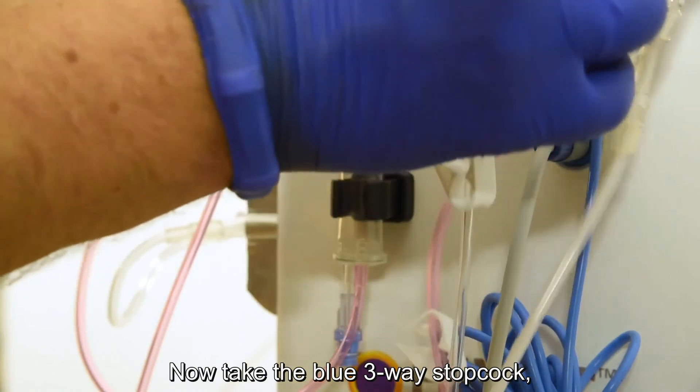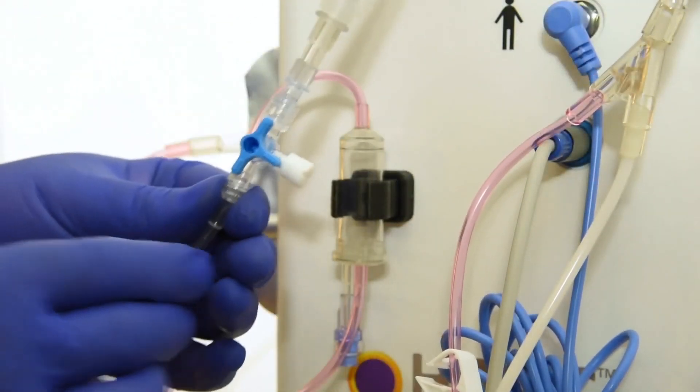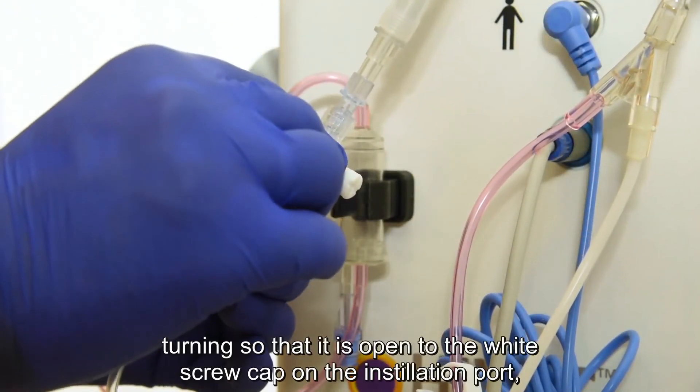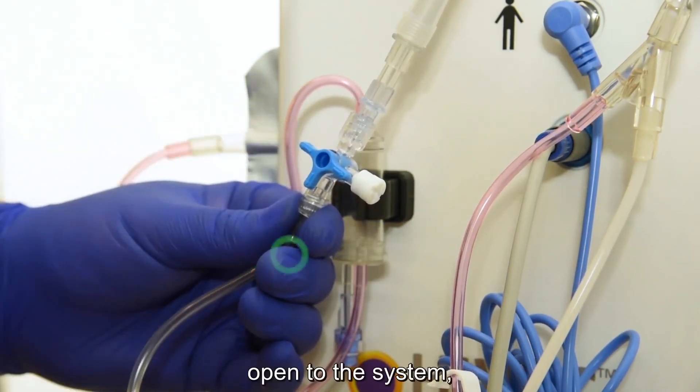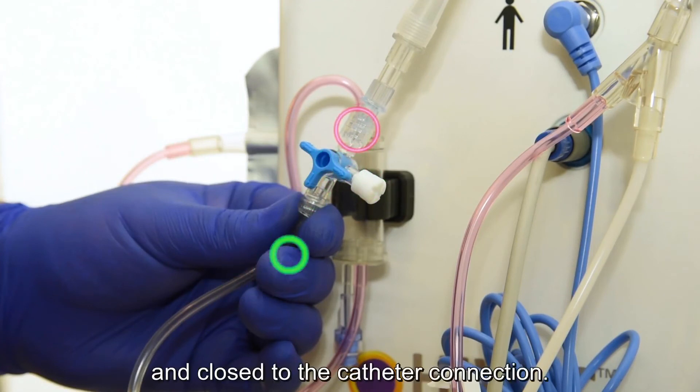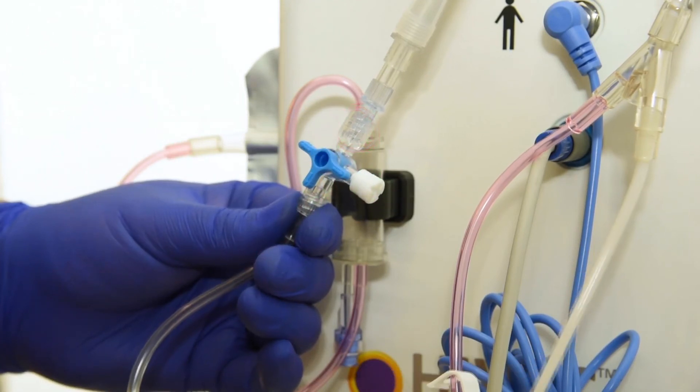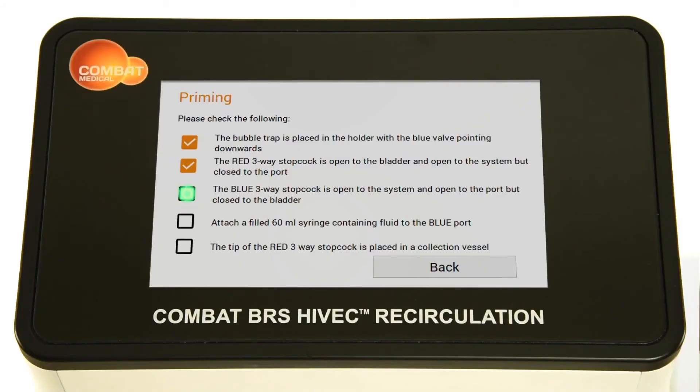Now, take the blue three-way stopcock, turning it so that it is open to the white screw cap on the installation port. Open to the system and close to the catheter connection. And confirm.